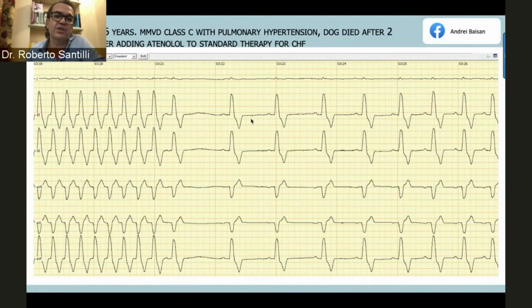If you see a worsening of the conduction along the AV node, because he already has a bifascicular block, you just stop the drug. For all the arrhythmias that are sustained, either ventricular or supraventricular, we like to monitor with the Holter, also with telemetry, but I think a Holter is much better, because you can go back and see what happened at the peak of the different drugs.